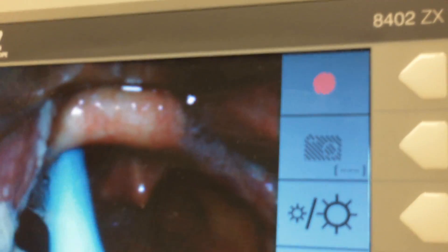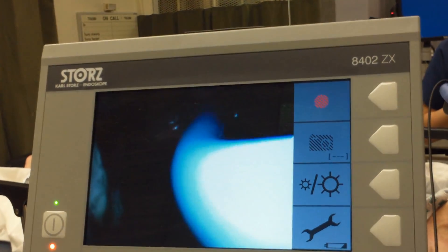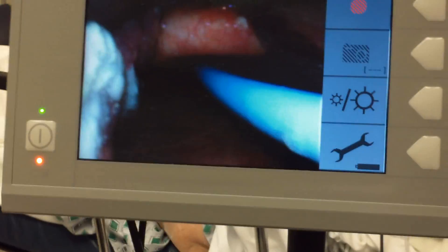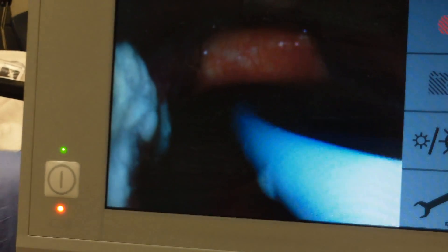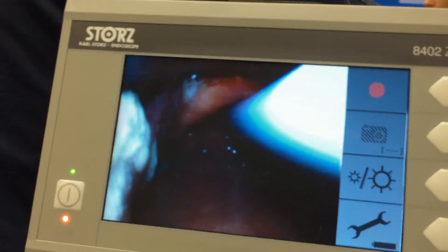Looks like you're about there. You're off to the side a little bit — yeah, it's bending. No, you're off to the side. The cords are fine, go ahead. There you go. You feel those rings? Yeah. You're in, man. Oh, now I feel it. Feel like clicking? Yeah. That's it. Feel like a little vibration there? That's it. That's what you're supposed to feel.